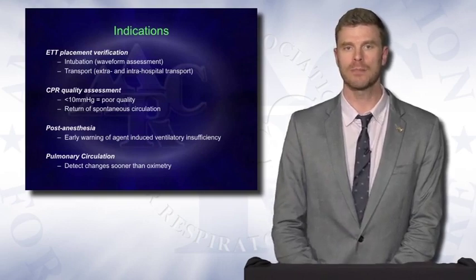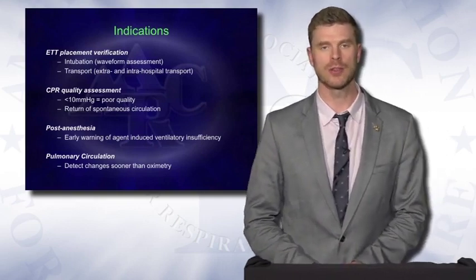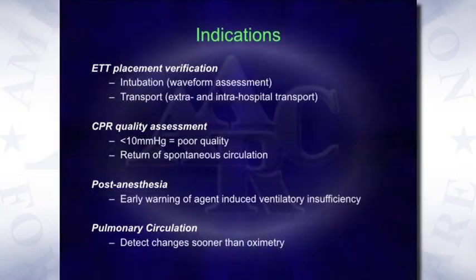During transport as well, it's an important tool to be able to make sure that the airway is intact and that our mechanical ventilator or our bag is actually connected to the respiratory system. This can be done both within a hospital and from hospital to hospital.